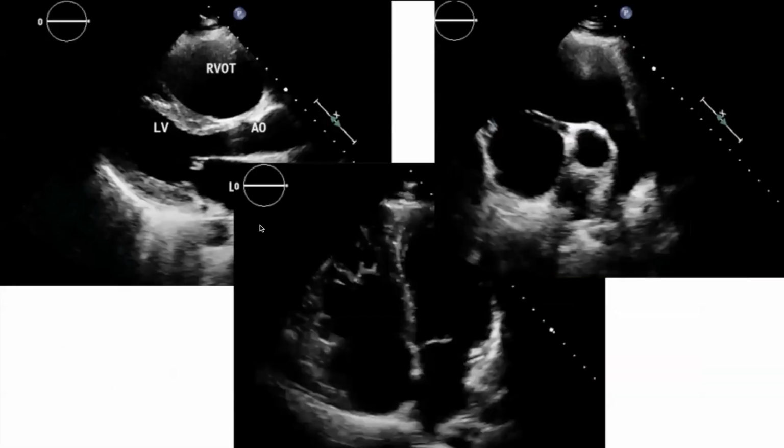And then just to show a couple more clips here of quite dilated RVOTs. These are some other patients that do have arrhythmogenic cardiomyopathy. And again, we can see that the RVOT is very, very dilated, maybe double the size of the aorta and the left atrium. Looking at the RVOT on the short axis, again, very, very dilated RVOT, and it corresponds with a very dilated right ventricle as well.